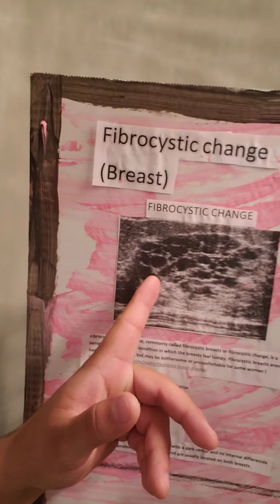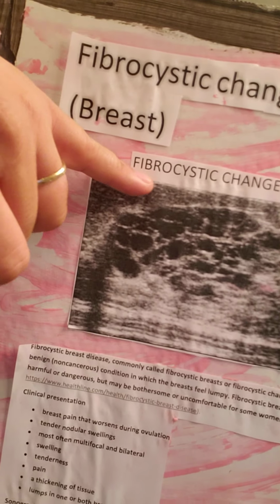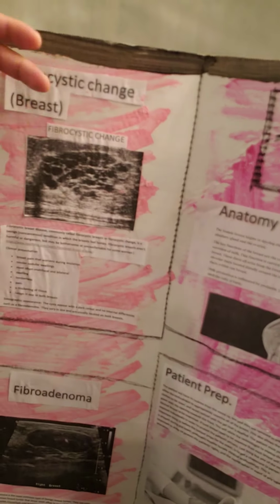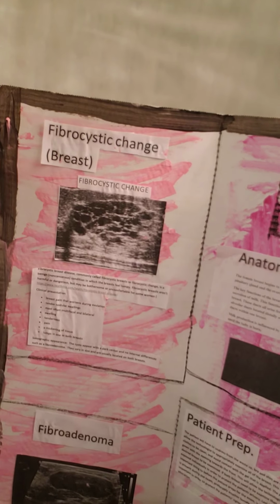So as you can see here, this is what we call anechoic. In the middle of these, anechoic means that there's no reflections of ultrasound. The ultrasound is cutting right through it, and then, as you can see, let's say this is the top, where the transducer is, where the probe is, where we put it on top. Basically, it's going through it and then hitting a tissue right below it and then bouncing back up.